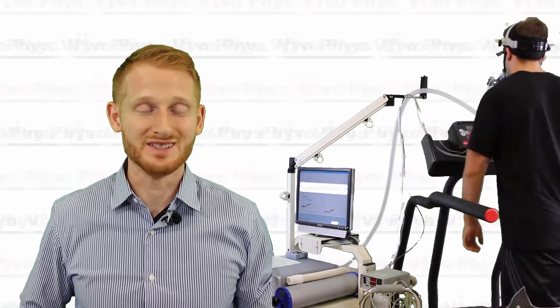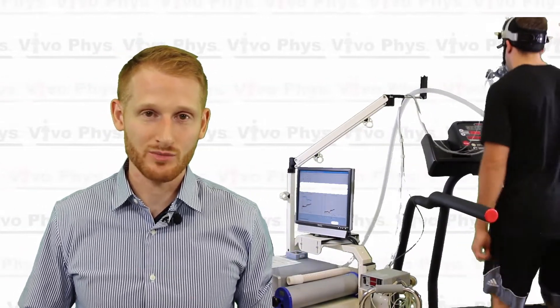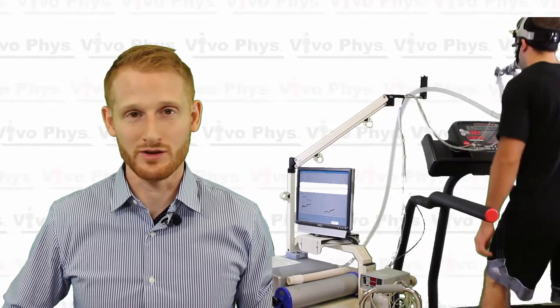Keep in mind that when you're doing a maximal treadmill test like what we're doing here, you're going to want to record heart rate, blood pressure, and RPE—ratings of perceived exertion—and you want to do that typically every stage if it's a stage type test. If it's a ramp protocol, choose regular intervals to do those measurements.